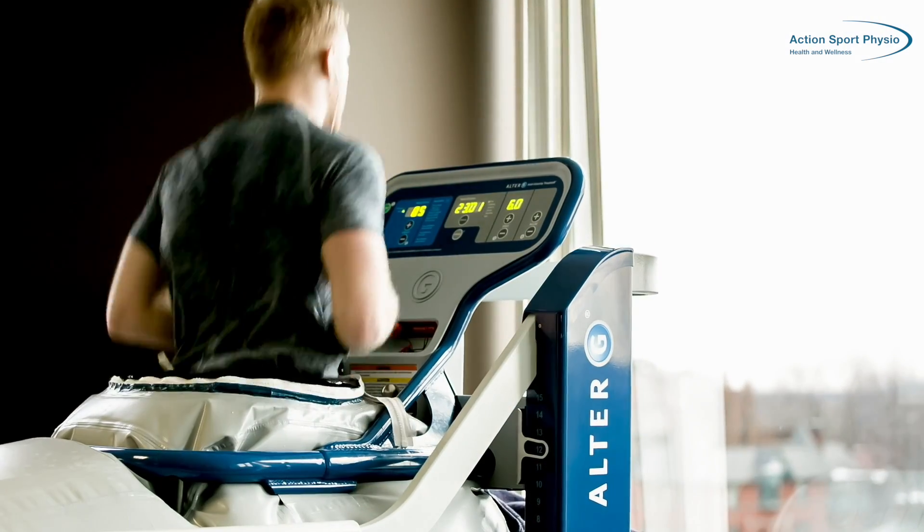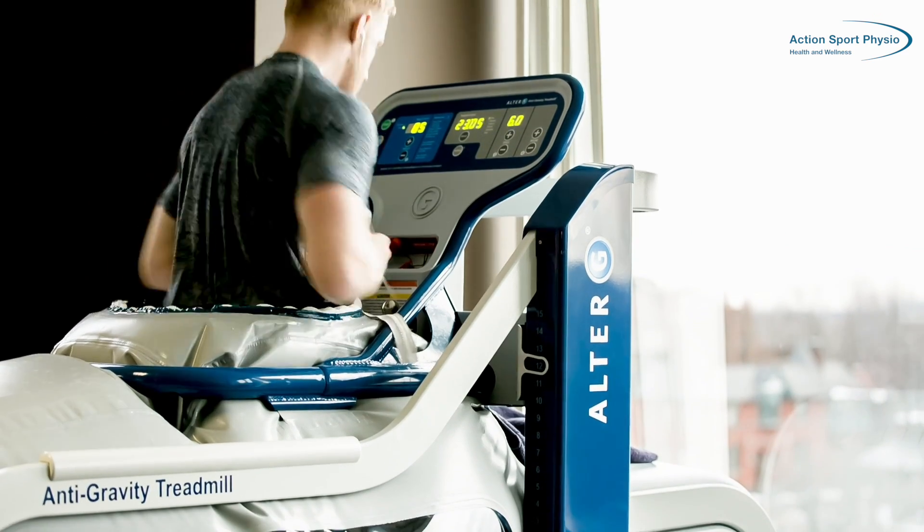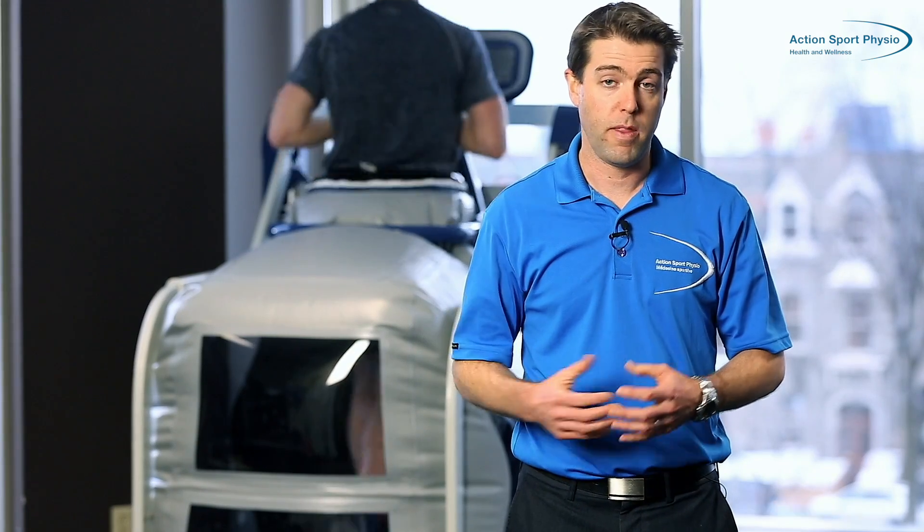And as their condition improves, instead of increasing the time of the training, we will just increase the body weight from 50% to 55% to 60% and eventually to 100%, depending on how the recovery goes for the runner.